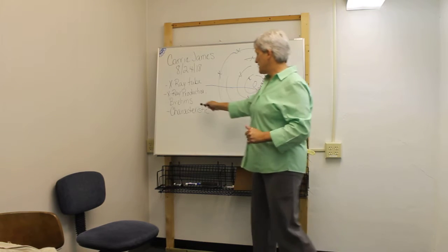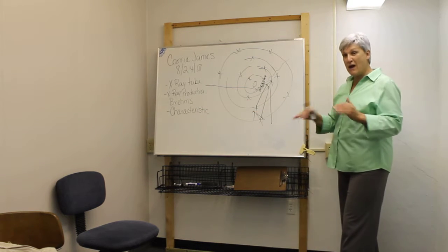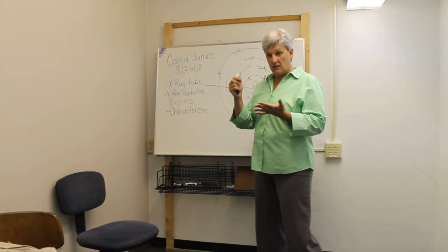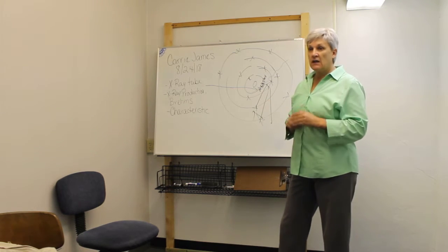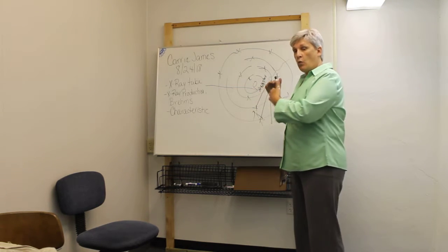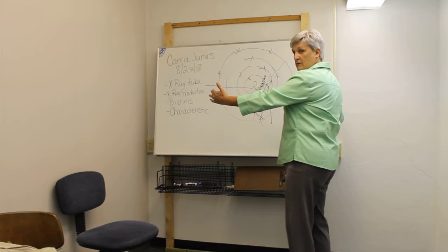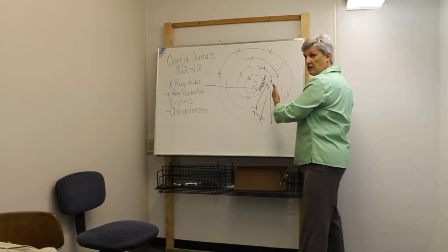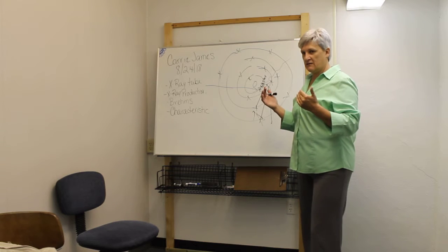we know that we're going to produce an X-ray at 70, right? However, we still have Bremsstrahlung going on. Bremsstrahlung is going to happen no matter what energy we use, because we use different energies in X-ray. We use 50 all the way up to 120 kVp. So when we're doing that, we can produce Bremsstrahlung all through the spectrum. We only have characteristic at 70 and above. With that, we have what's called a very heterogeneous beam.